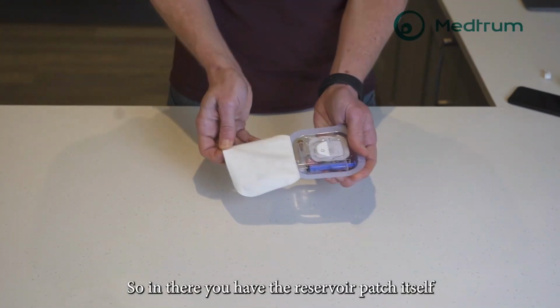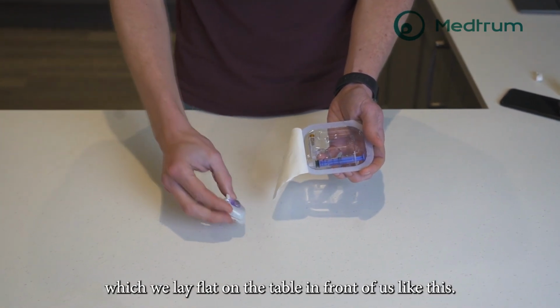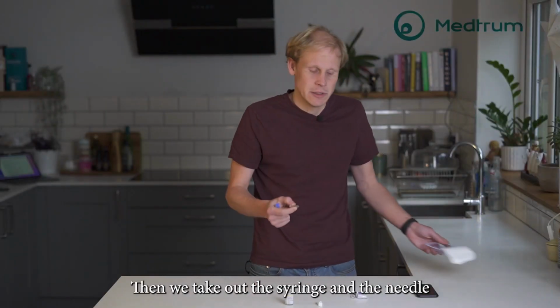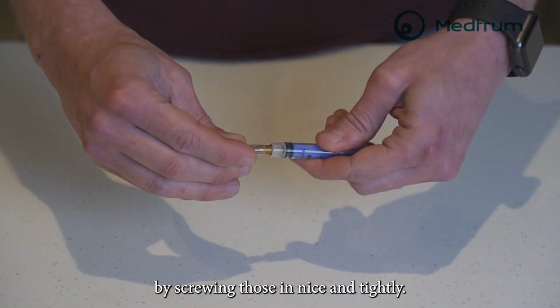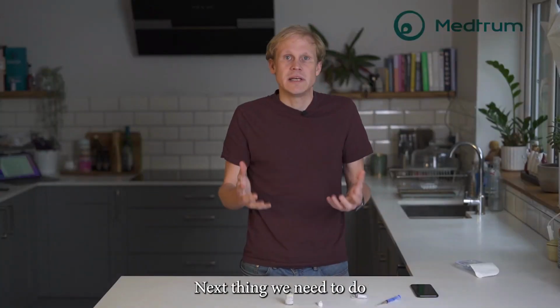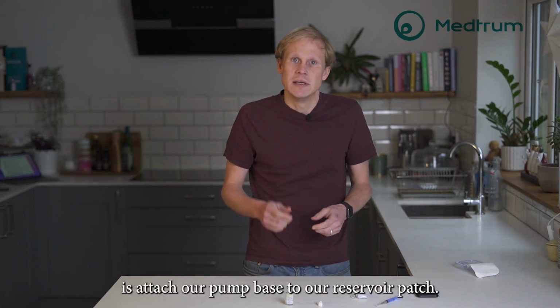So in there you have the reservoir patch itself, which we lay flat on the table in front of us like this. Then we take out the syringe and the needle, and we attach those two together just by screwing those in nice and tightly, and then you can place that on the table in front of you, and we'll come back to that shortly. Next thing we need to do is attach our pump base to our reservoir patch.